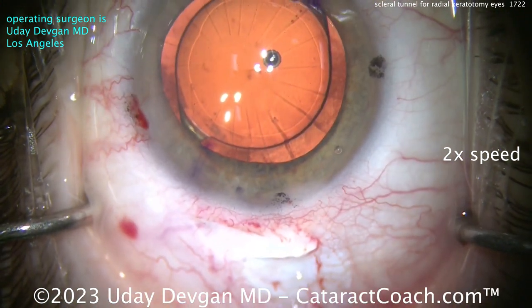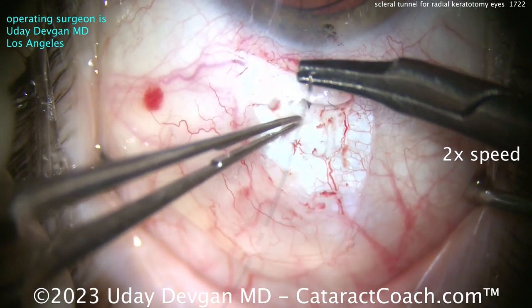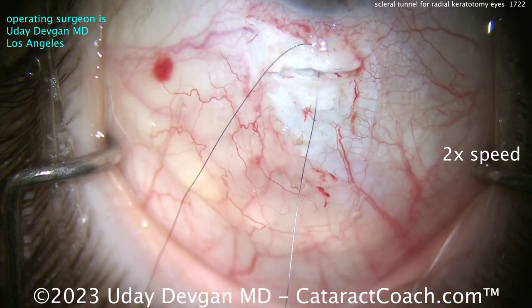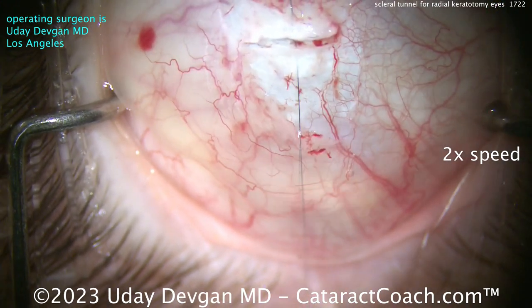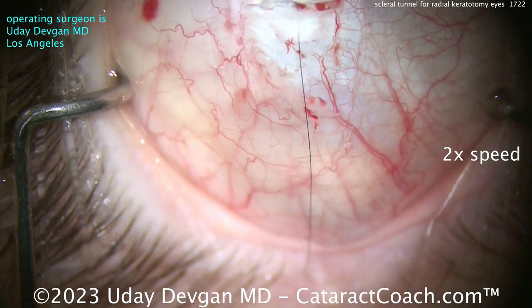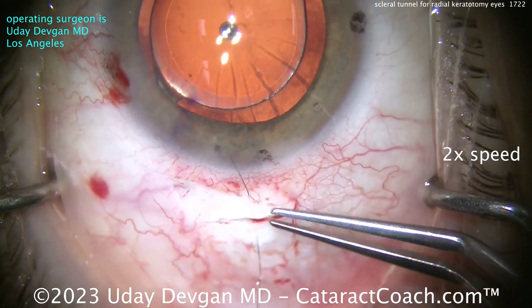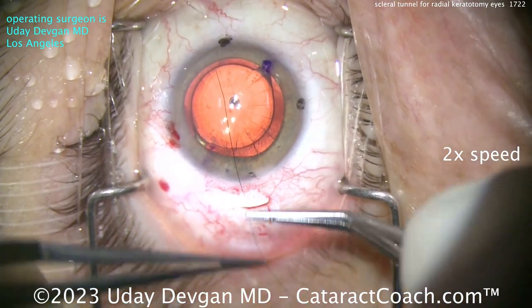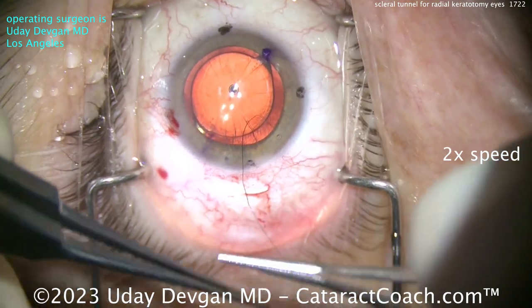Now, at the end here, you can see the lens is in good position, overlapped by the rhexis. Time to put a 10-0 nylon in. You could leave this scleral tunnel alone and unsutured — it's a small incision, it'll seal, it's already not leaking. But I would rather just put the suture in here and have minimal risk. We'll put that 10-0 nylon inside and close that incision. You want the anterior chamber pressure normalized at a normal IOP when you tie these sutures down so that you get appropriate amounts of tension.